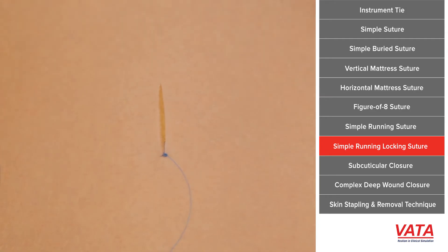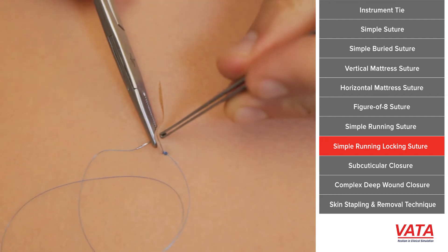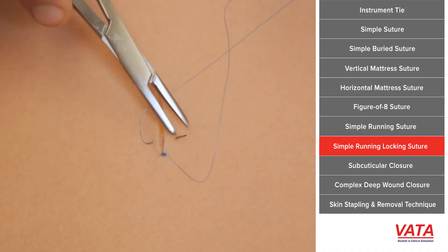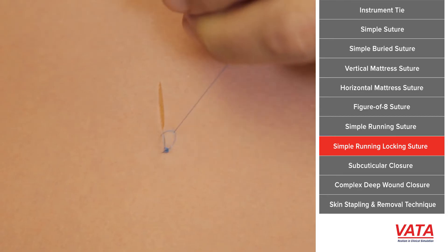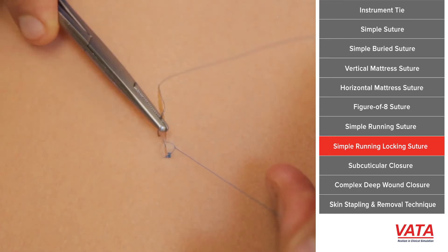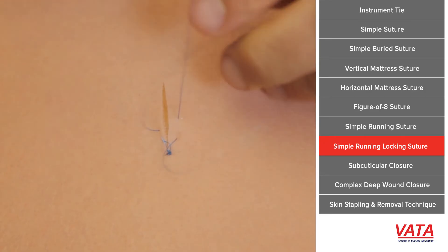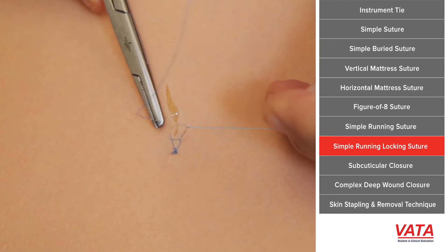What I mean by locking is: you take your simple bite, and now before you pull it completely through, you take the needle and you pass it through the loop. So now it's like a little pulley — it closes down and locks it in place. Then you go ahead and take your next stitch, making sure it comes back through the loop.